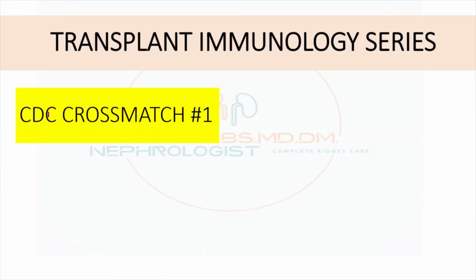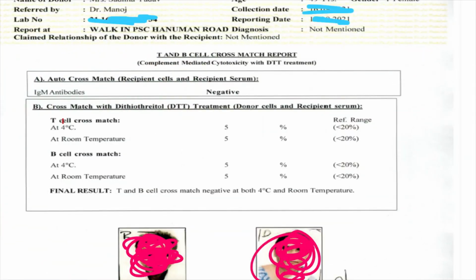So what is this CDC crossmatch? CDC is complement dependent cytotoxicity. But before going into that, we'll see one sample report. This is how the CDC report looks.